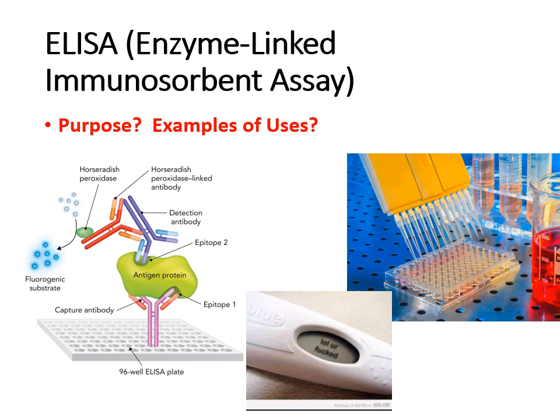So, for instance, if you take microbiology classes at CSI, you will do an experiment, a practice ELISA, where you are looking for HIV in samples, and you can detect which patient samples are infected with HIV and which ones are not. So you're able to look for a particular antigen in a sample through using a series of antibodies.